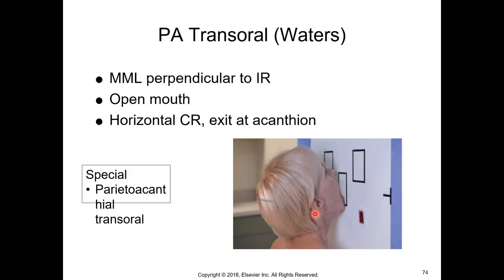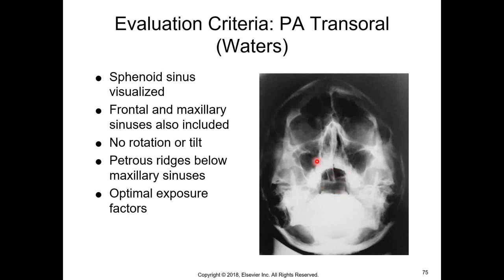And this is a picture of a transoral where her mouth is open, and that's so gross. I would not do that to my patient, but that's besides the point. What you're doing, you're still positioning the patient just like you would a regular Waters. The nose is not touching, so you're still getting that 37-degree-ish angle. But the big thing here is that the mouth is open. And when the mouth is open, you're able to see those sphenoidal sinuses, which are right here, projected into the open mouth.